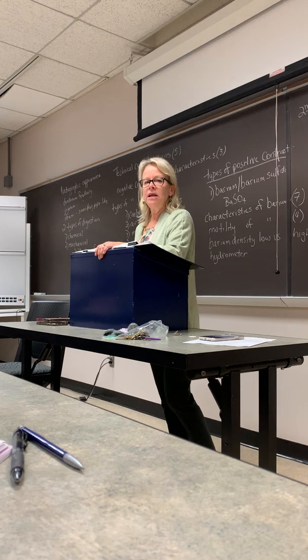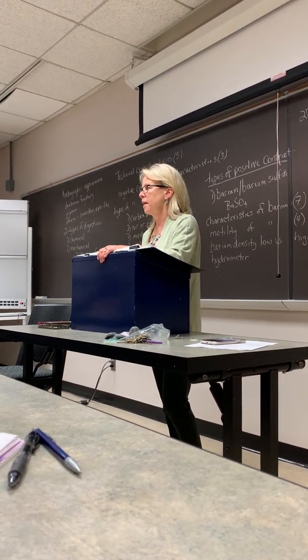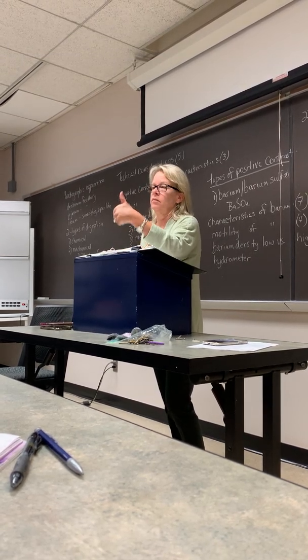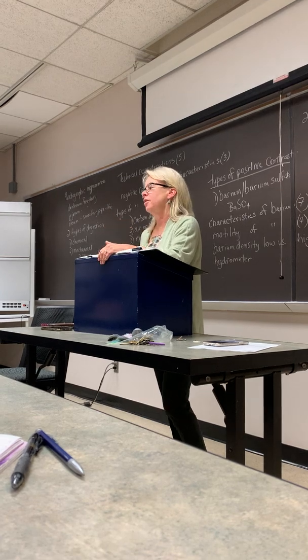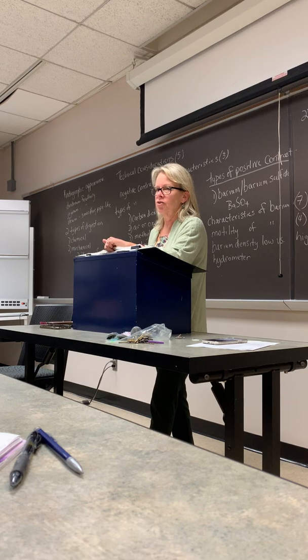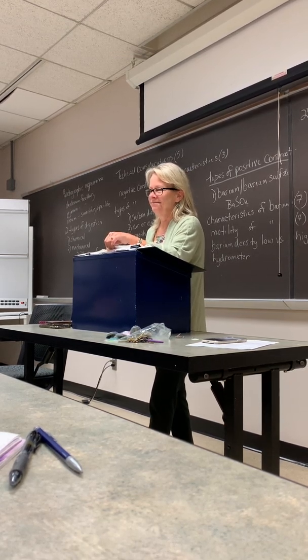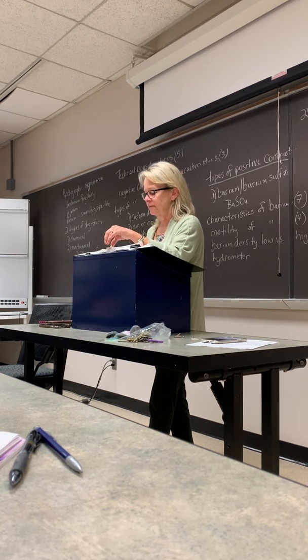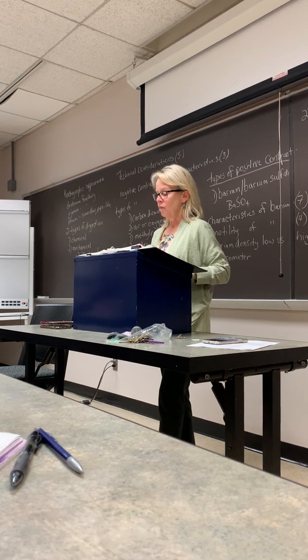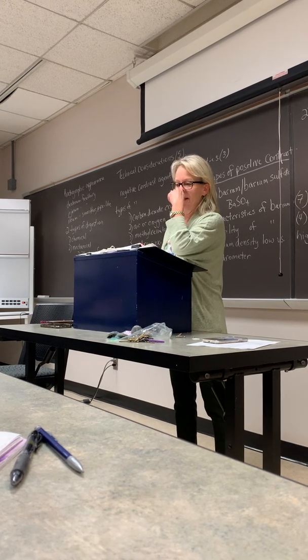What's the recommended KVP with the use of barium? What do you use KVP wise? 100 to 120. That's the recommended KVP. You guys never look at the control panels because it's just automatic, unfortunately. 100 to 120 KVP is the recommended KVP.